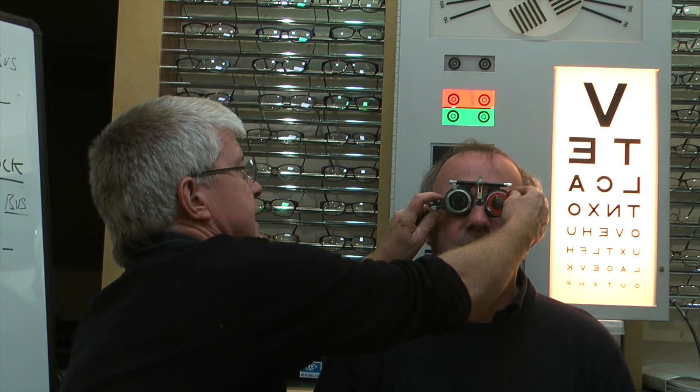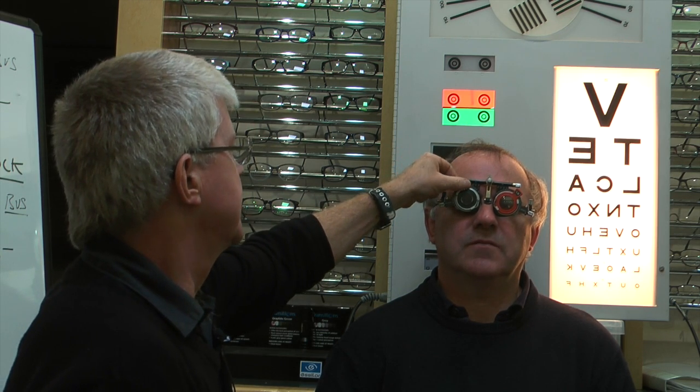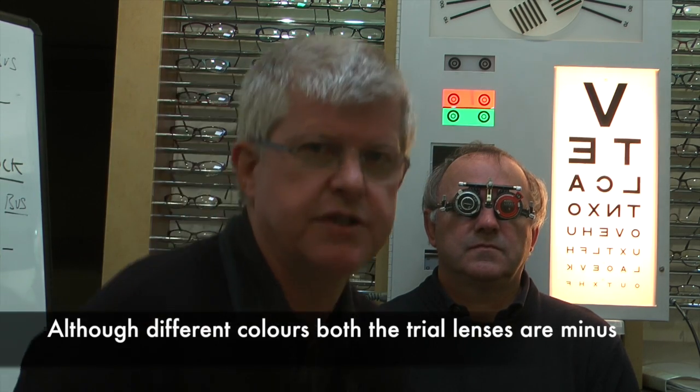We're going to end up with a minus 1.75 in the left eye as the best vision sphere. We're putting a minus 3.25 in the right eye. When the best vision sphere is working, it means the circle of least confusion is on the retina, giving us the best compromised vision with a spherical lens.